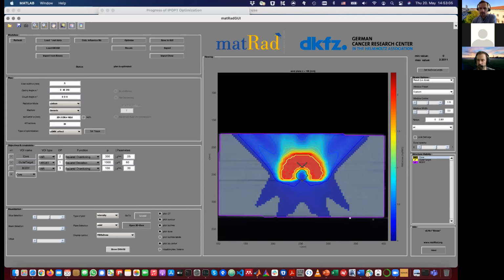Was there another question, or shall we wait 1 or 2 minutes before I continue? No, I think optimization questions are done now.